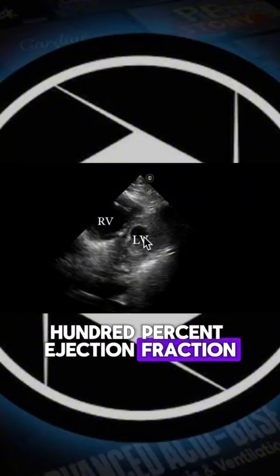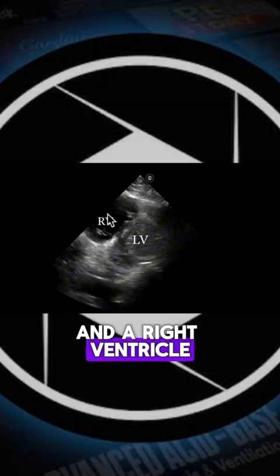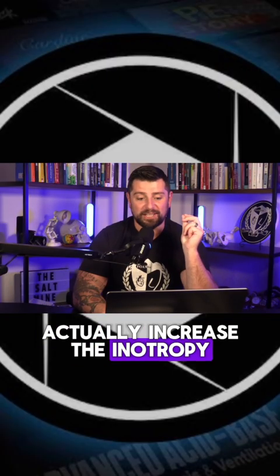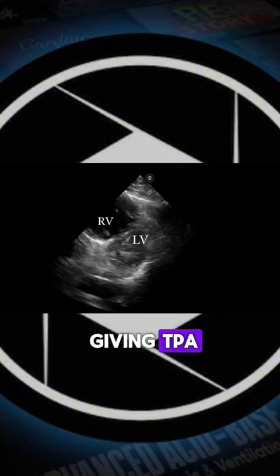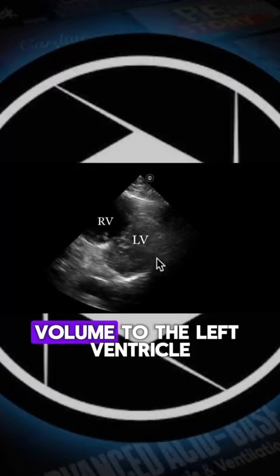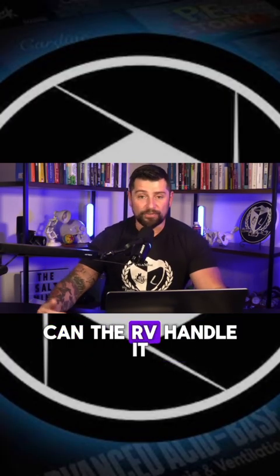100% ejection fraction. So we have a left ventricle that's fluid responsive and a right ventricle that would not tolerate any more fluid. So we'd have to actually increase the inotropy of the right ventricle with things like epi, maybe try to reduce the clot burden by giving TPA, pulmonary vasodilators. But we can't get volume to the left ventricle without going through the right ventricle. And that's why I have, is there evidence of right ventricular strain, or can the RV handle it, as part of my checklist?